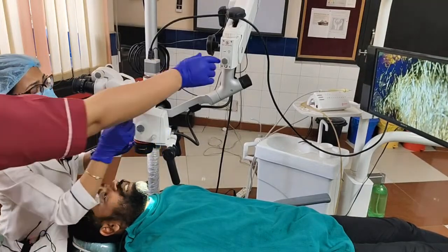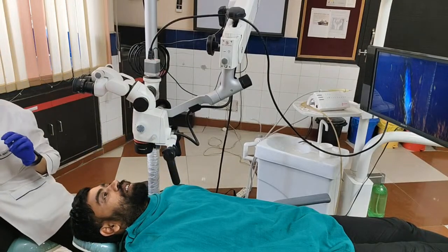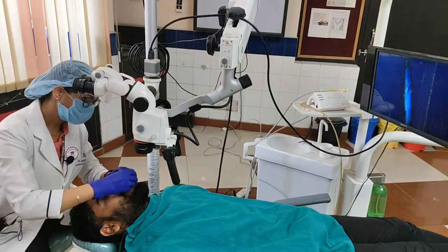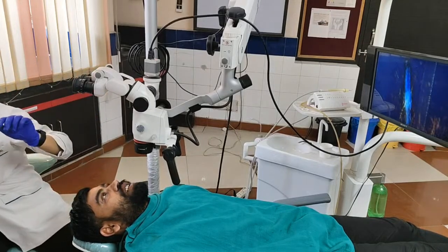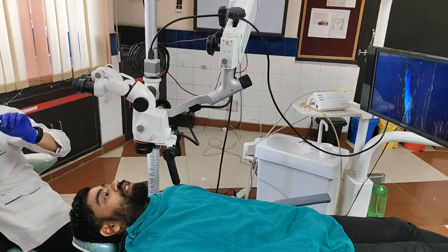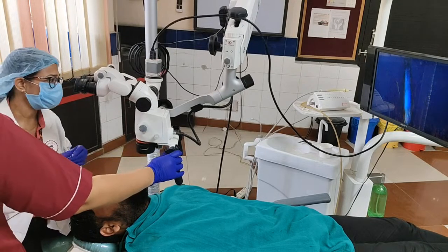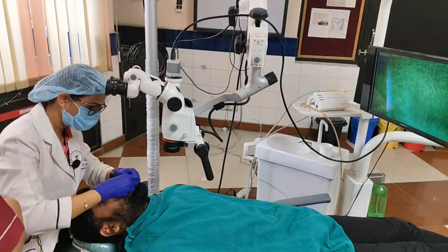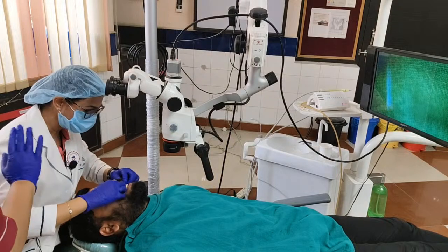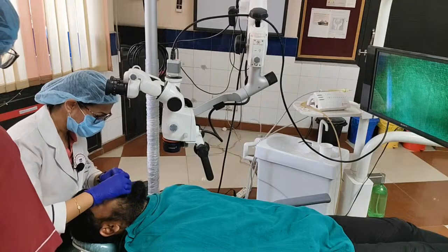Meanwhile, if the patient is not too busy and he can wait, so that you can see similar in the lower, you can see the laser tipping. Okay. And in fact, you can do a hands-on class. Alright. So we'll just have a word with the patient, if he is okay to wait. Just give me a minute. I'll just get it confirmed in the OPD. Give me a minute, okay?